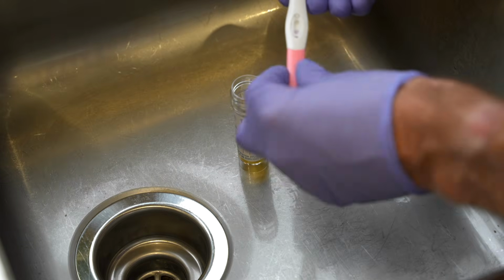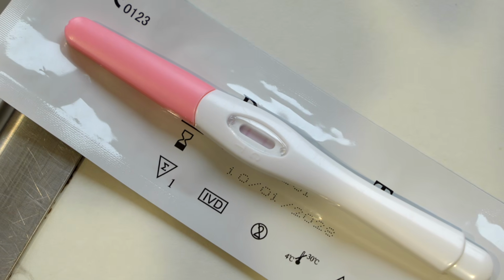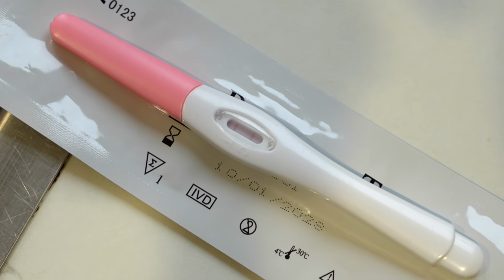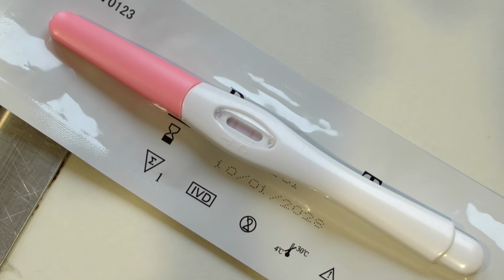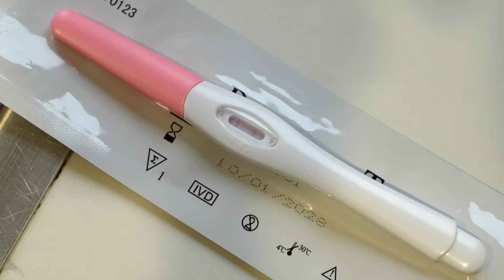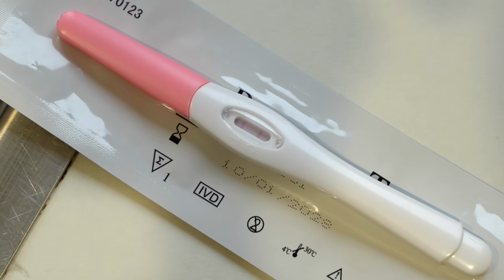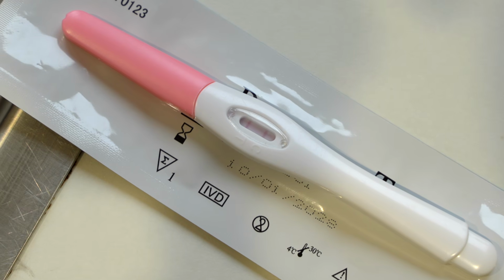And we're putting the end over. At which point we put the test strip horizontally and leave it for 1 minute, but already you can see that 2 lines are developing rapidly here. So if there's any doubt, you're going to make sure you give the whole 60 seconds and then return to the patient.